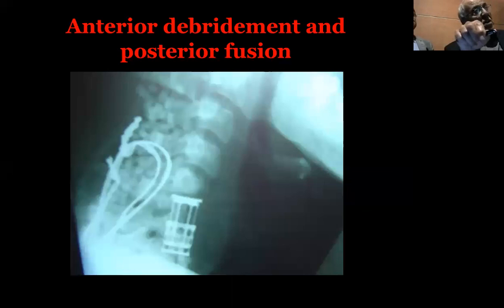This is cervical. Again, we went from anterior, removed the whole body of the vertebra, and fixed it from posterior also. At that time, we did not have the plates to fix above the cage.